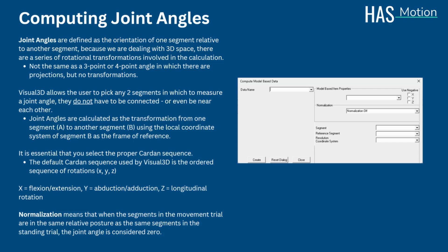The default Cardan sequence used by Visual 3D is the ordered sequence of rotations X, Y, Z, which assumes the following: X being flexion and extension, Y being abduction/adduction, and Z being longitudinal rotation.